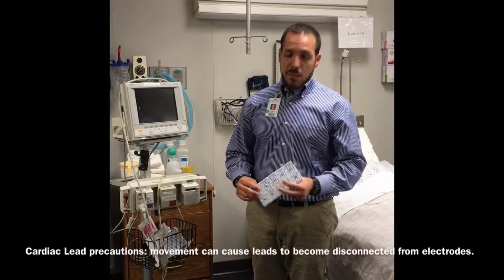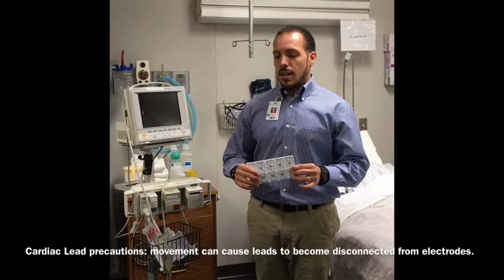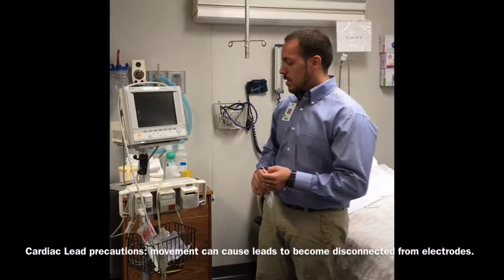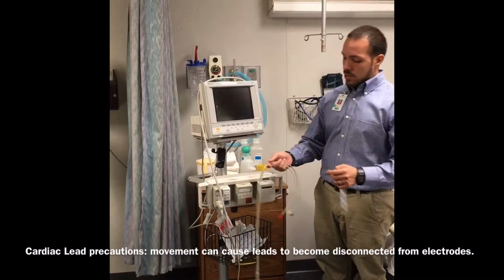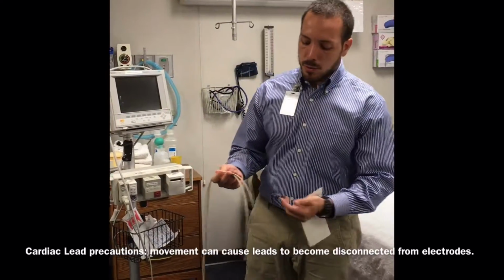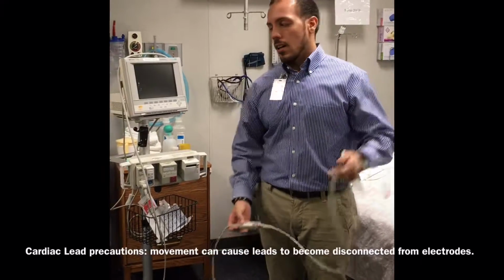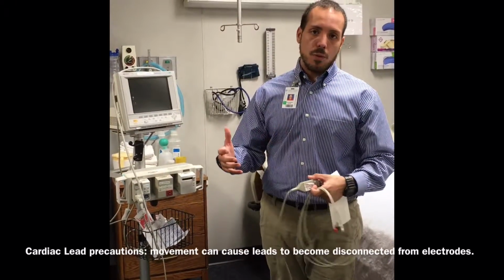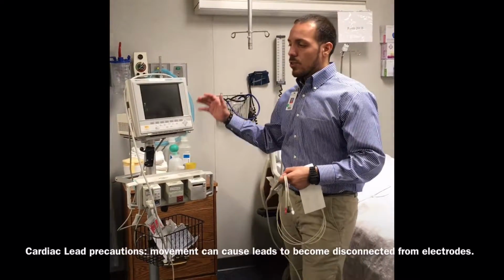The next device is going to be our cardiac leads. You're going to see these placed on the patient, and these we're not actually going to be removing before ambulating our patients, but you will see the actual cardiac monitor, and the leads and the wires themselves are going to be these. They're going to be hooked up, and all you're literally going to be doing is disconnecting it right here and turning off the monitor so it doesn't beep. Obviously, we're going along with all the precautions to make sure everything is safe, but you will not ambulate the patient when they're hooked up to the monitor.